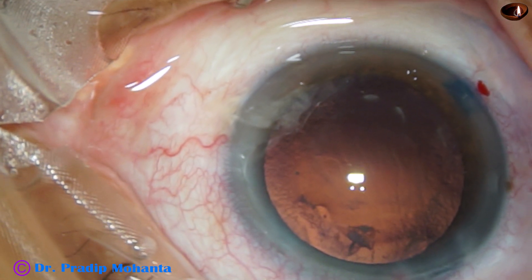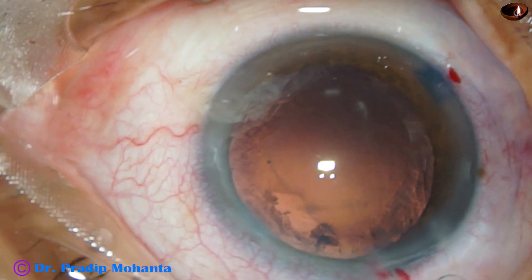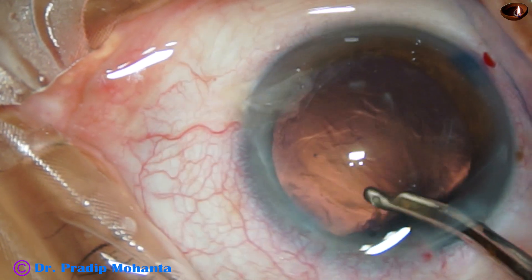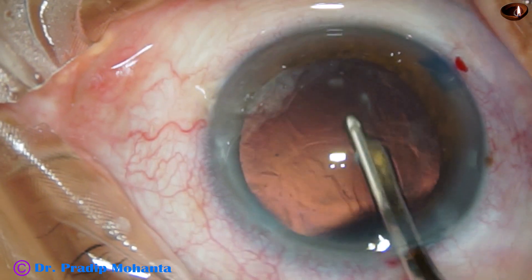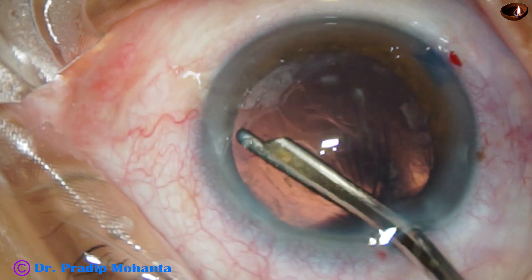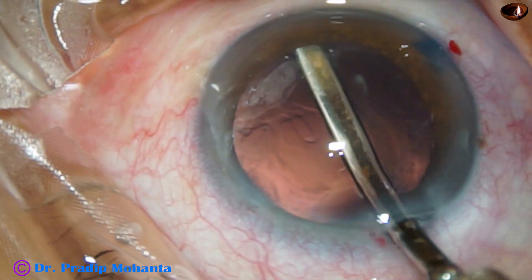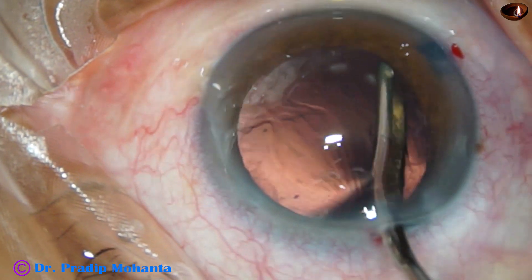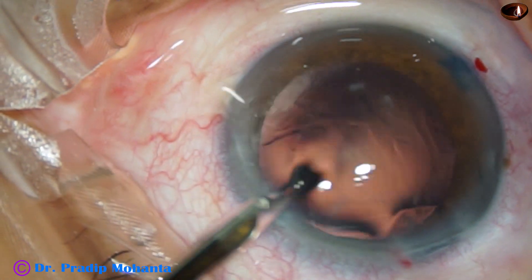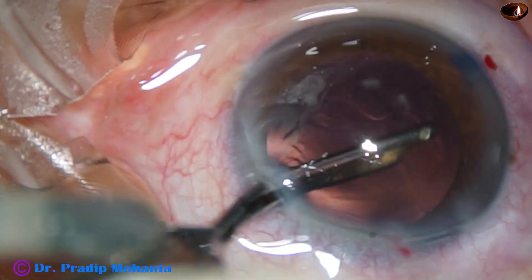And now cortical cleanup is to be done. There are some cells in the periphery and very little cortex as well. I am using a 23-gauge Simcoe to remove the cortex. Cortex from 1 o'clock to 4 o'clock has been removed. And this is polishing of the peripheral area of the posterior capsule, and this is cleaning of the under-surface of the anterior capsular rim. Going through the left side port to polish the peripheral part of the capsule from 9 o'clock to 12 o'clock.